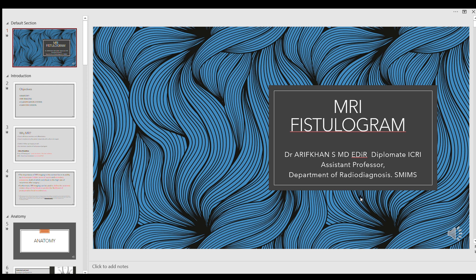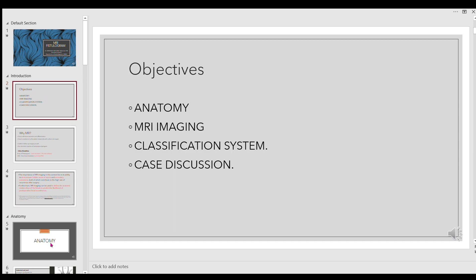We'll briefly describe MRI fistulogram basic anatomy and go on discussing how we plan for an MR fistulogram, the widely used classification systems, and we'll discuss some cases as well.